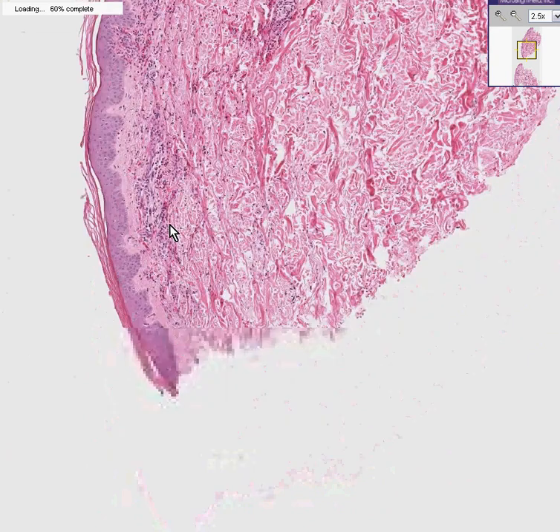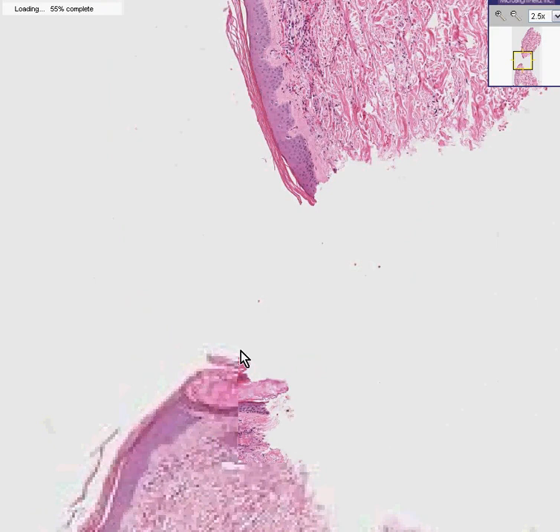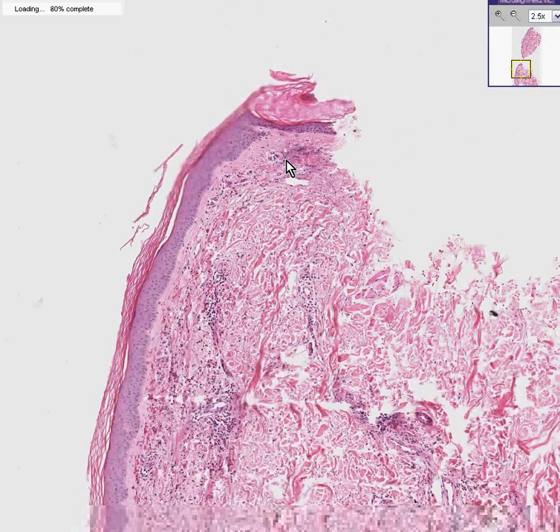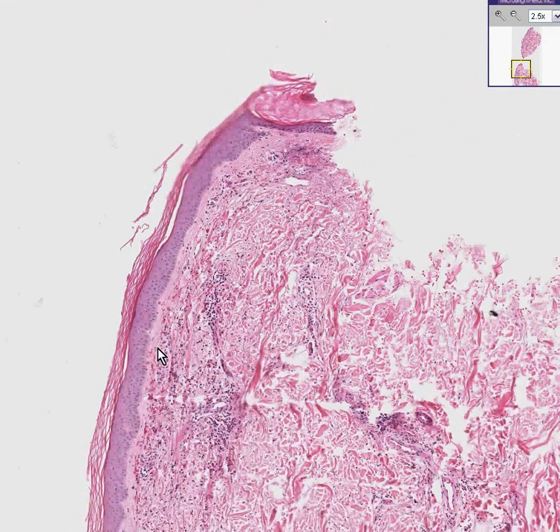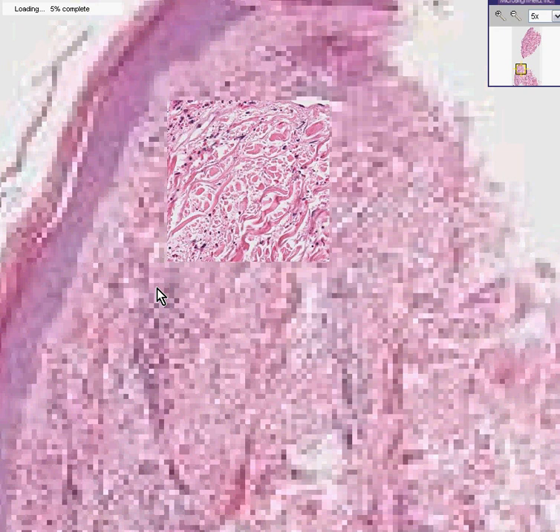Not only is it an inflammatory skin lesion, but the part of the skin that appears to be the most inflamed are parts of the dermis that are surrounding blood vessels. So this is a vasculitis — it's a dermal vasculitis.